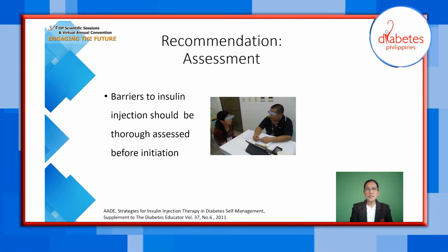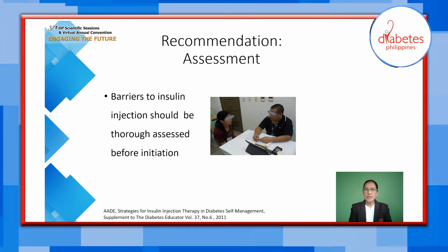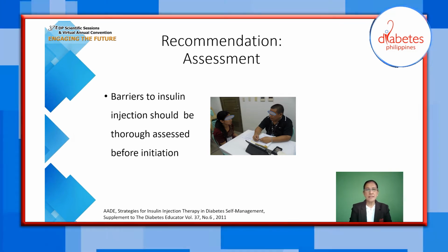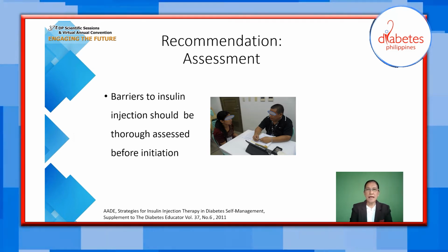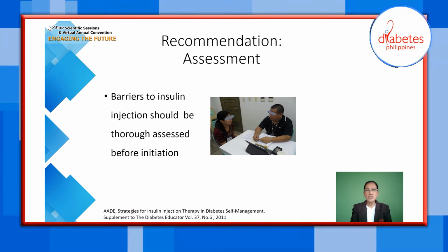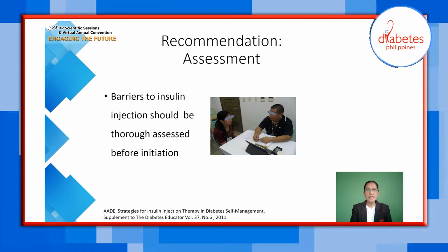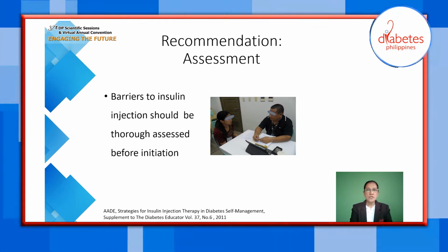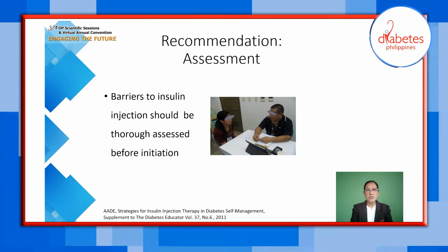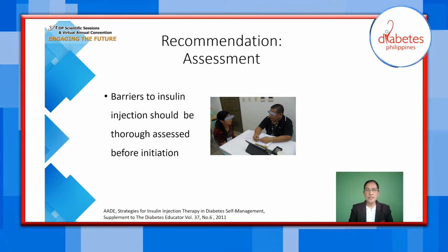First and foremost, before you start teaching your patient about injection technique, you have to assess first the barriers to non-compliance. Kailangan po nating malaman kung meron bang agam-agam ang pasyente natin, kung meron siyang hindi naiintindihan tungkol sa insulin. We have to address everything. You have to dig deeper. Use different approaches in order to elicit a lot of information with regards to barriers of insulin injection technique, especially the actual insulin injection.